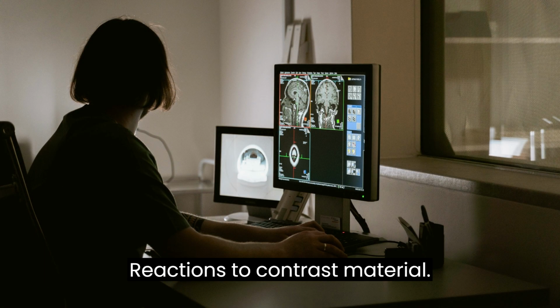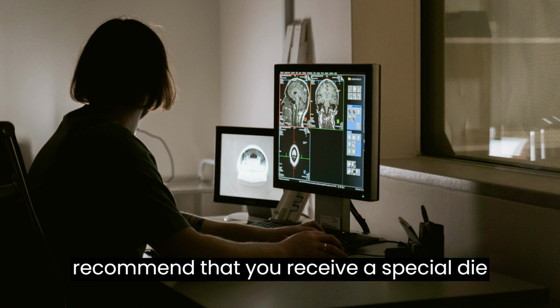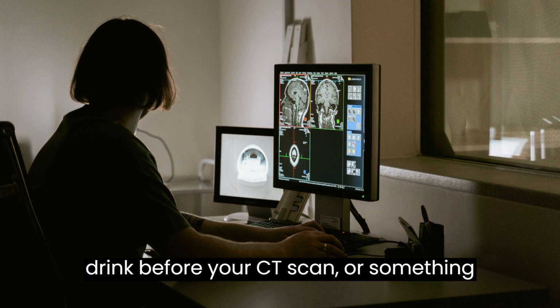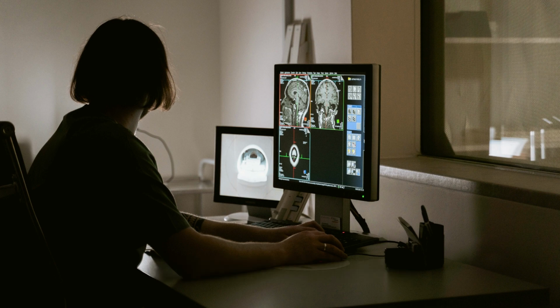Reactions to contrast material. In certain cases, your doctor may recommend that you receive a special dye called contrast material. This can be something that you are asked to drink before your CT scan, or something that is given through a vein in your arm or inserted into your rectum.